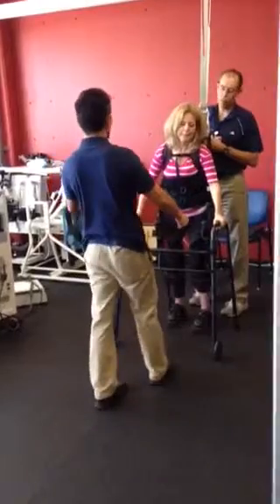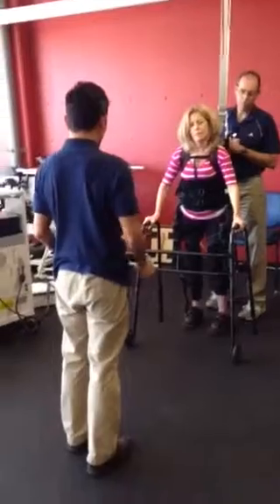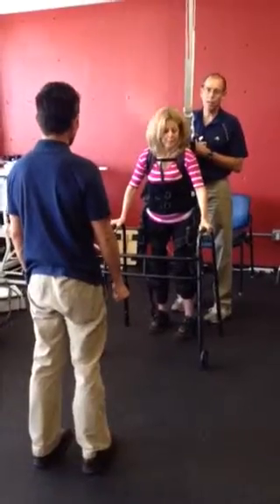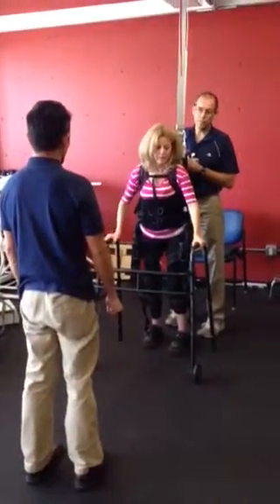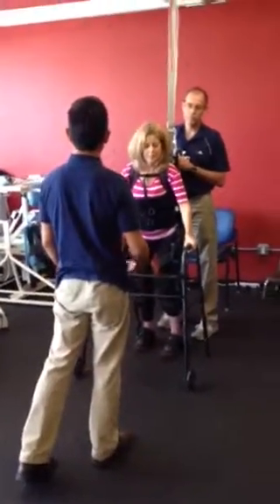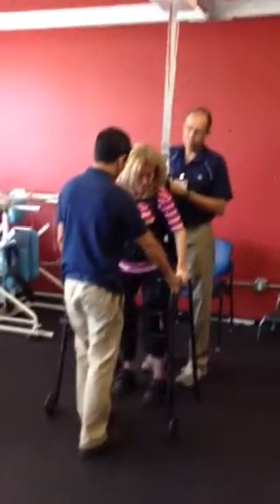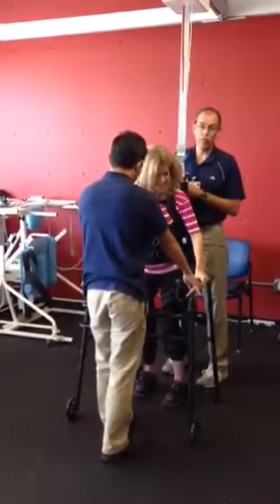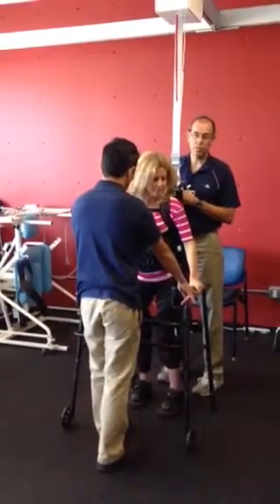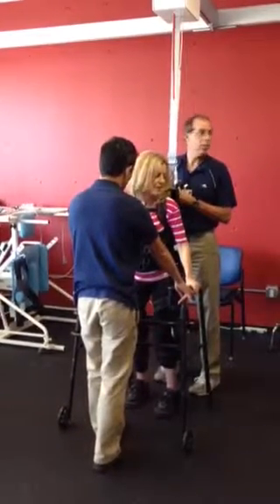But you don't take the step — we do. What you're going to do is get that walker far out of the way so you don't do this. Move your arms to the spot and we tuck them into that spot. And that shifting of your weight over there will help you. If we find the exact sweet spot, you don't even have to use your arms — she's balancing really well. So you're close to that right now. I'm barely having to hold you.